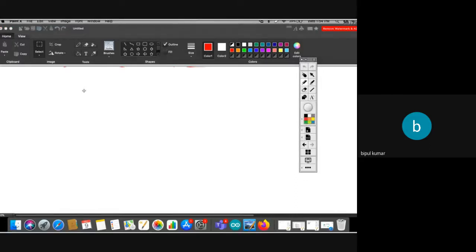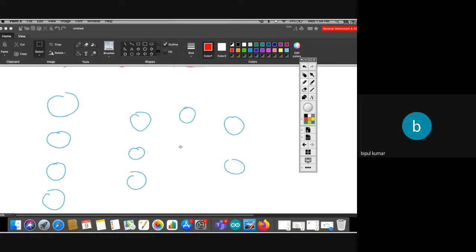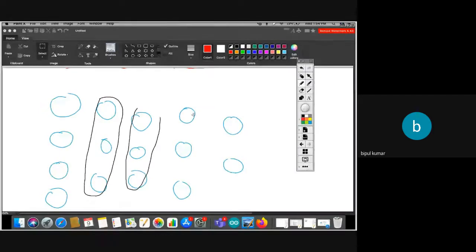If you talk about the sequential model, it works like this. You have input neurons, then hidden neurons, then output neurons. There can be multiple hidden layers, like hidden layer 1, hidden layer 2, hidden layer 3. The first input layer is connected to the first hidden layer, this is connected to the next hidden layer, and then the output layer. That is how the sequential model works.